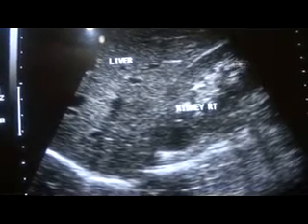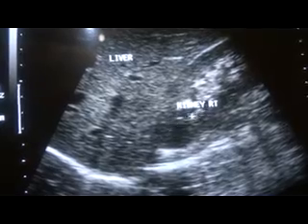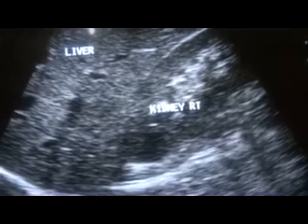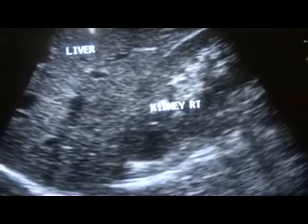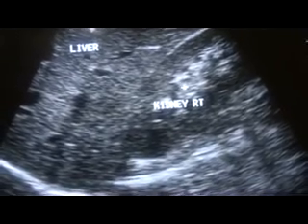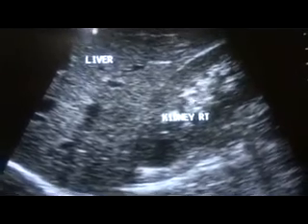This is the expected normal echogenicity difference between the liver and right kidney parenchyma. This you have to remember — keep it in your mind, store it in your mind. The more the normal you know, the better you will be in finding or depicting the pathology.